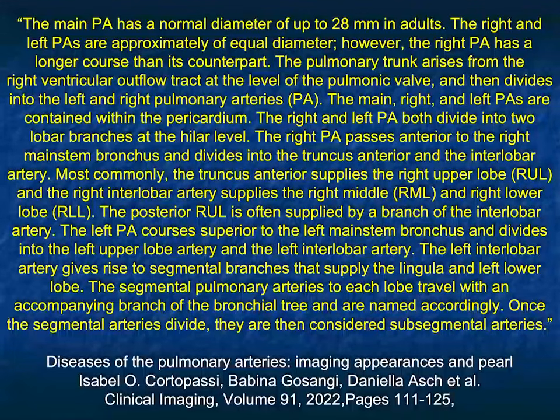But we don't speak that much about pulmonary artery aneurysms because the reality is they're fairly uncommon. They can be somewhat tricky to diagnose. And what we're going to do over probably 2 lectures is look carefully at this topic, look at a number of examples, look at the key imaging perspectives, look at the key clinical perspectives, and try to learn more about them.